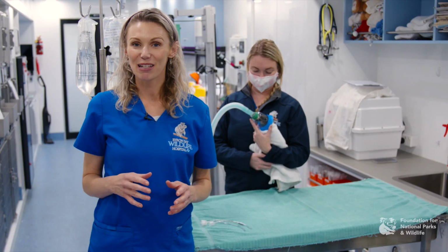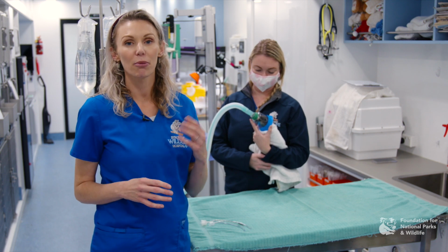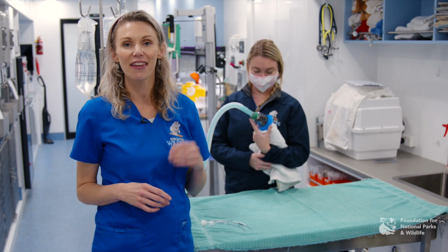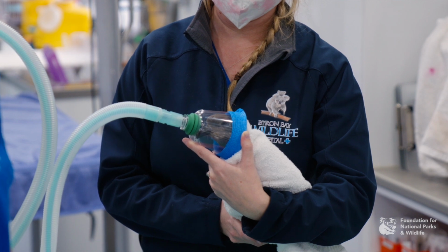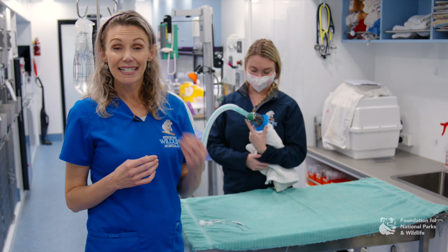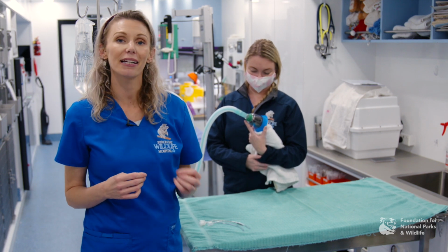To anaesthetize a seabird, it's much the same as a normal bird. Place the mask over the face, provide oxygen for several minutes, and then induce with isoflurane. They might have the diving reflex and hold on to their breath. That shouldn't be too much of a problem. You just wait for them to take a breath, and it might just take a little bit longer. As they get anaesthetized, they're going to slowly close their eyes, and that allows you to determine the depth of anaesthetic. Ideally, if you can, intubate any bird so that you can maintain a patent airway.